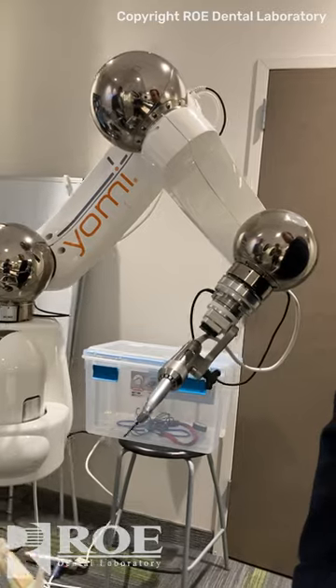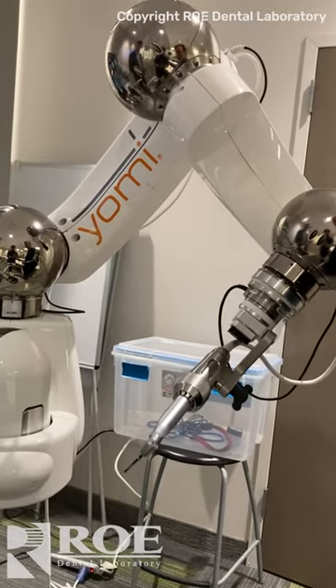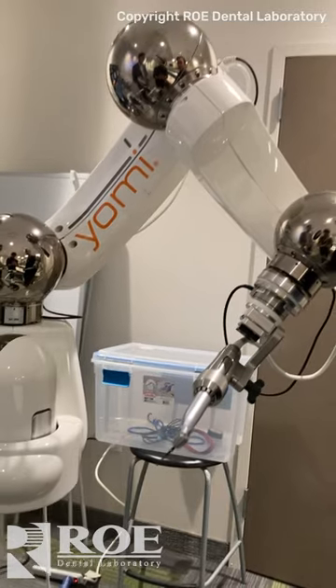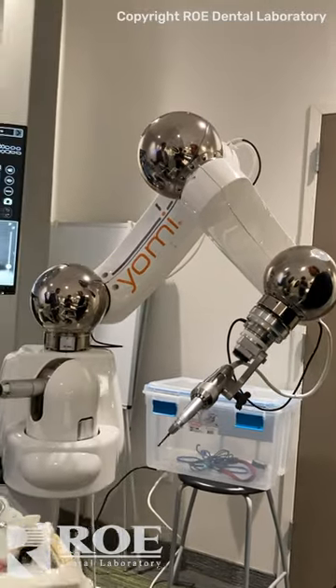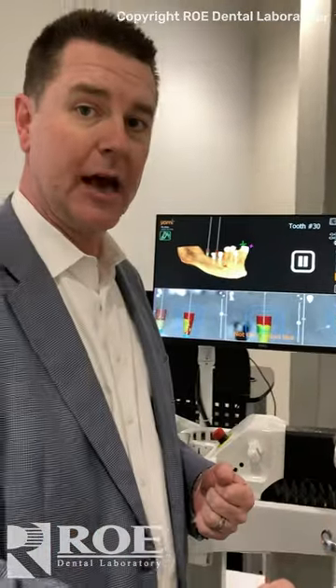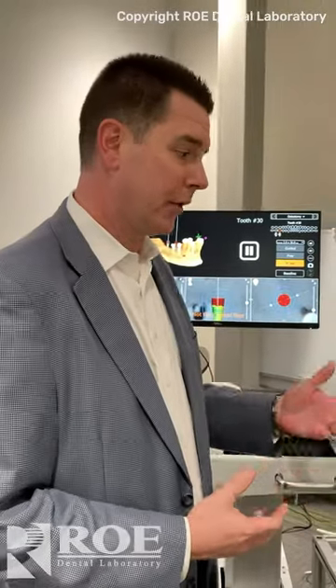This arm is what we call our guide arm. It mimics a human arm in that it has a shoulder, elbow, and wrist joint, and this is where you get all of your physical or haptic feedback from. You have audible and visual cues on the screen here with the robot, and the actual arm is going to guide you to the exact angle and location where you've planned to place your implant. Once the angle and position is locked, you have the ability to drill to depth, and it will physically stop you from over-drilling and drilling where you don't want to go. So it's very, very safe.